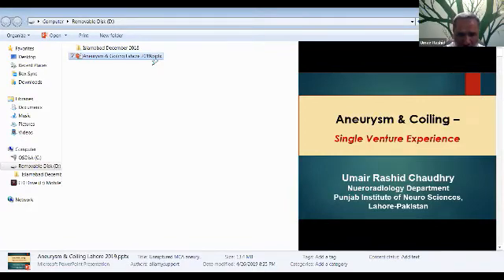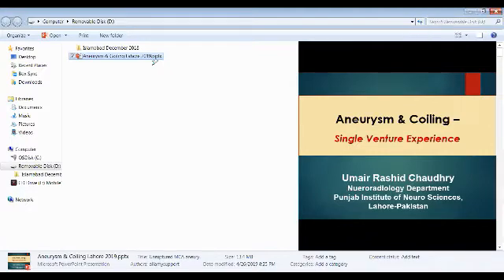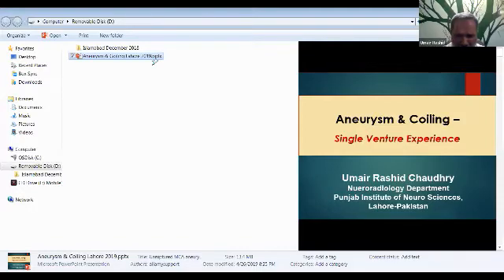Because we have some net issues here in my setup, this is another which I have shown you, the holy grape sort of a shape. And this again changes according to the peri-aneurysmal environment. And generally people go for stent-assisted flow diverter, but we did the simple coiling.